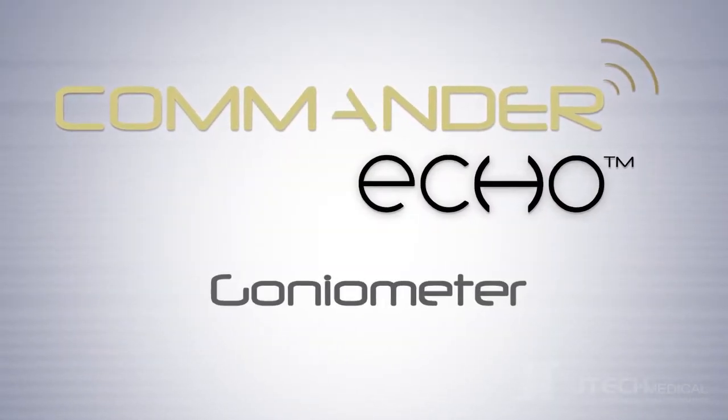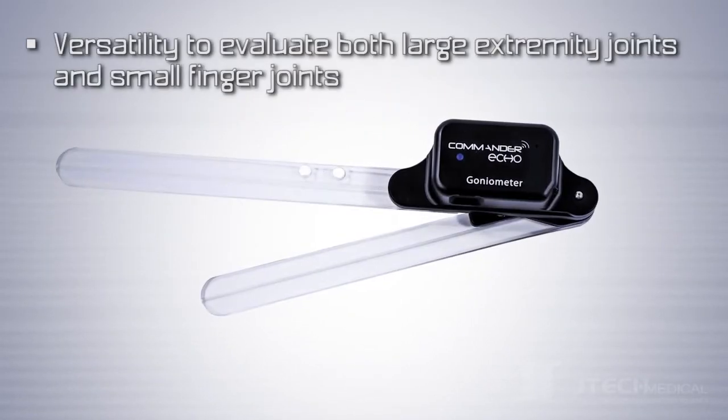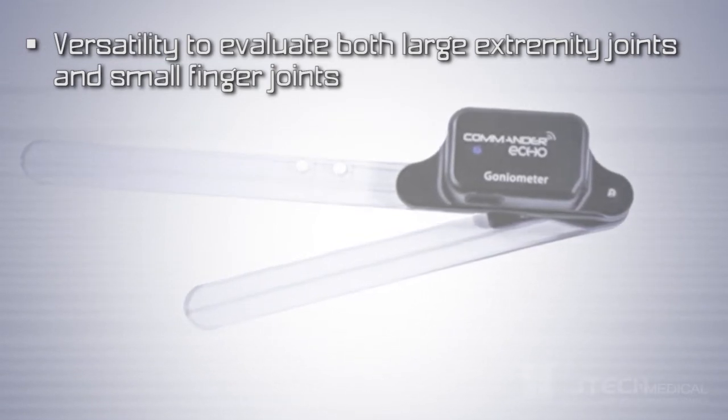Introducing the new Commander Echo Goniometer. Here are some great product features. The Commander Echo Goniometer has the versatility to evaluate both large extremity joints and small finger joints.